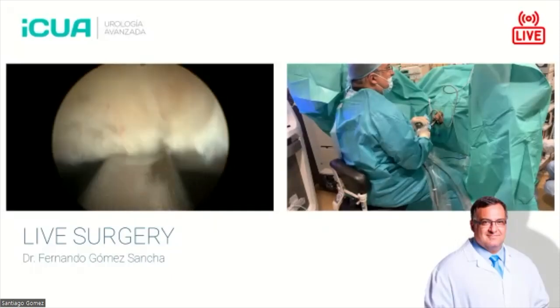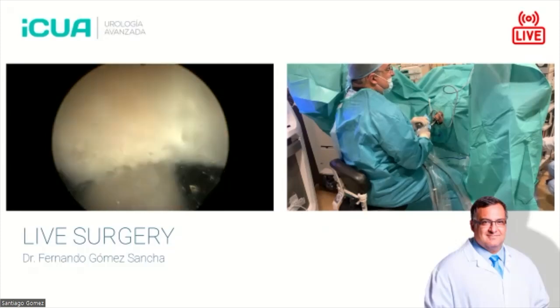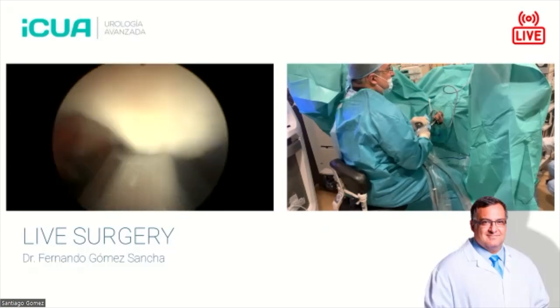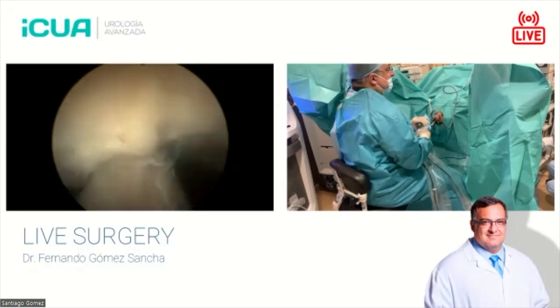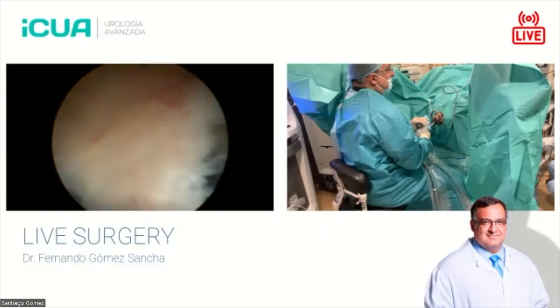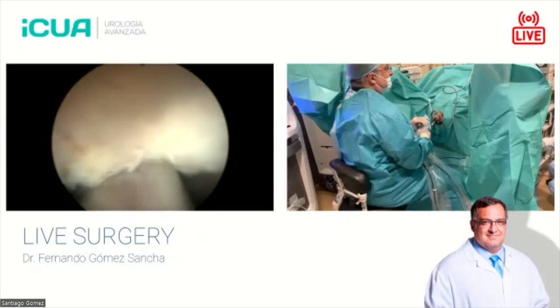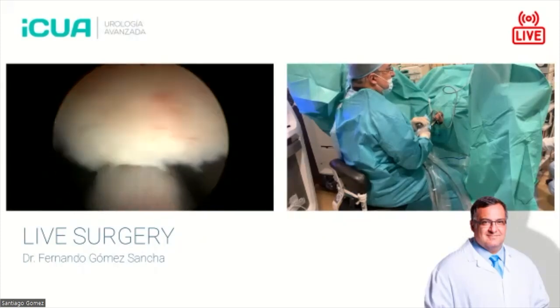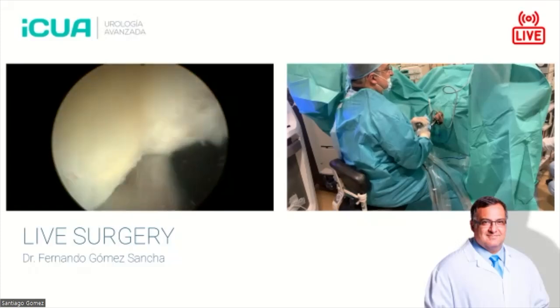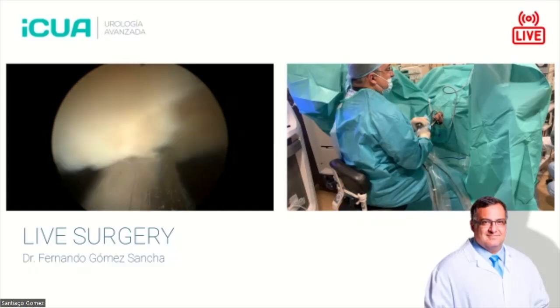Only when morcellation is not efficient, when you see the mouth of the morcellator a lot, and you keep sucking water, then there is danger of emptying the bladder and causing trouble. So for morcellation, you have to guarantee that you have a good hemostasis, and this laser is amazing in that respect because we usually have very good visibility.